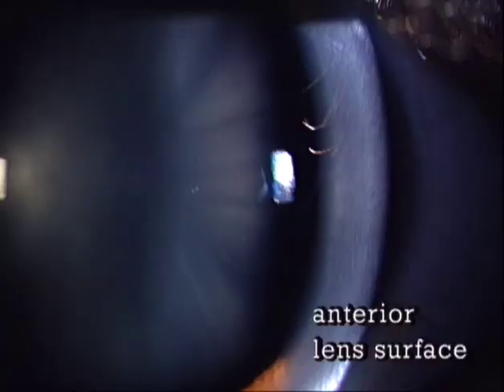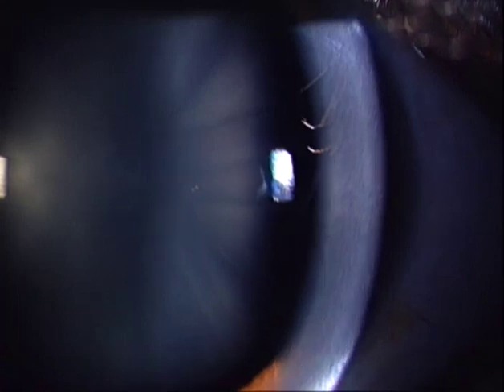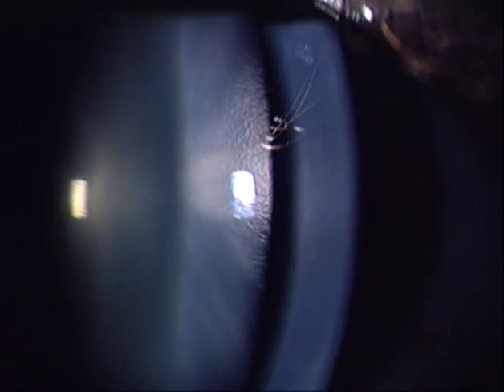Here we see the anterior lens surface brought into focus at a given area. The microscope, together with the illumination unit set at a fixed angle, is rotated from the right to the left, as can be seen by a slight change in perspective of the lens, until the specular reflex begins to appear on the lens surface.